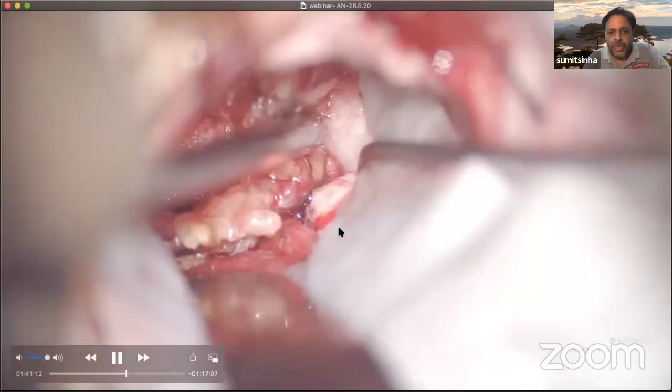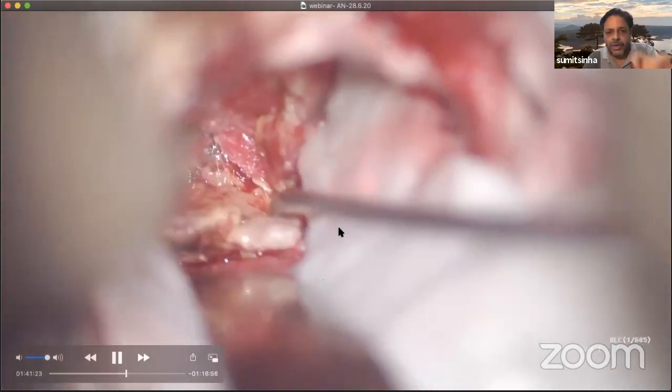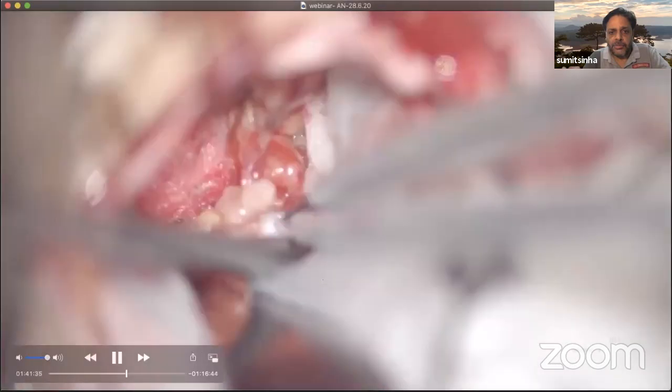So once I have identified the facial nerve, I'm pretty confident that I have got at least one location of the facial nerve, and then I have to be very cautious about going in around that vicinity.